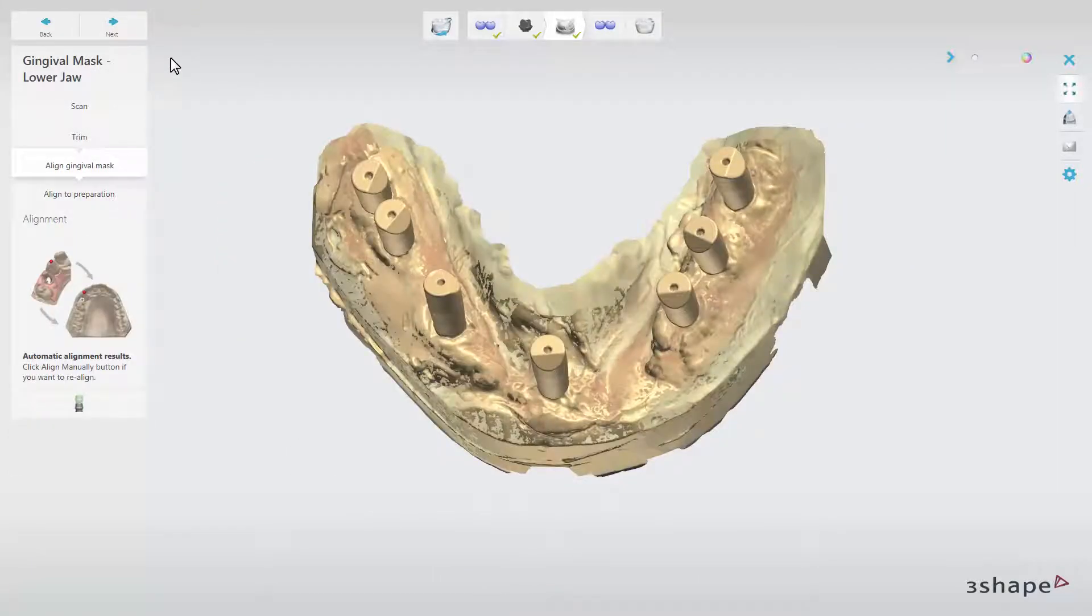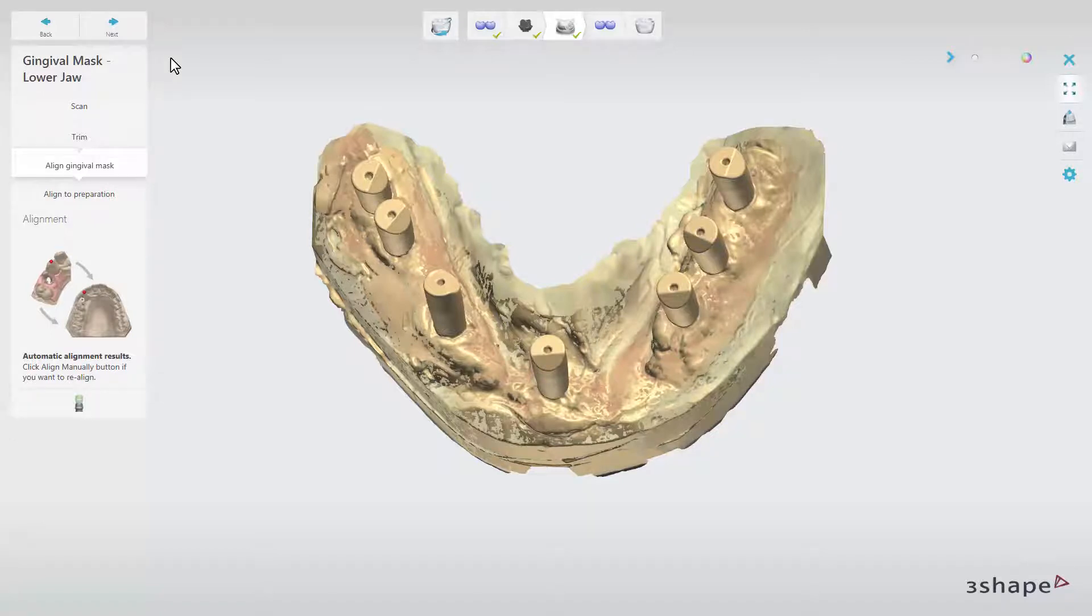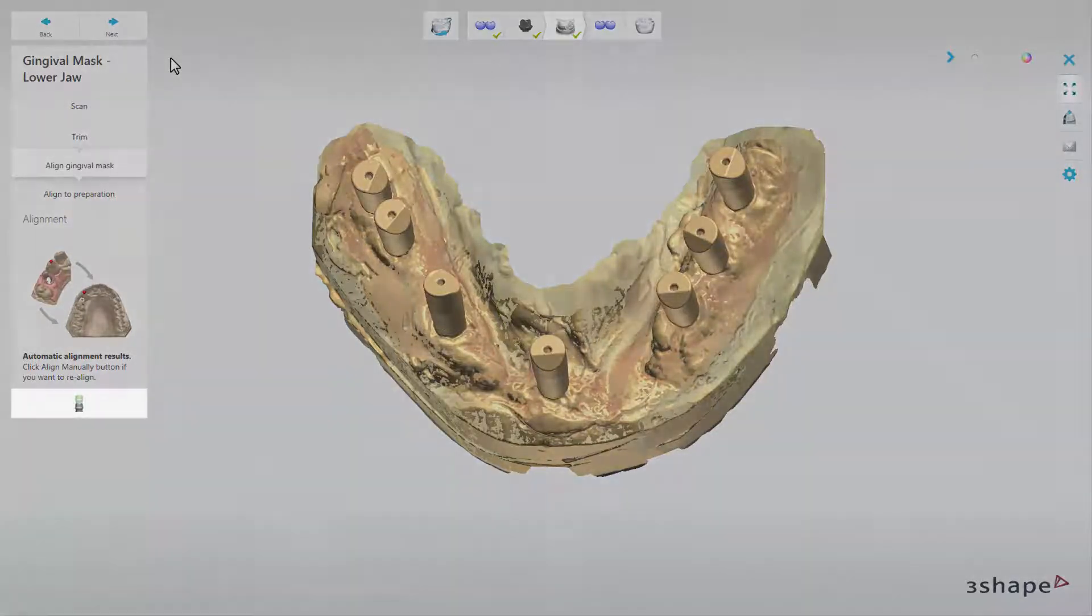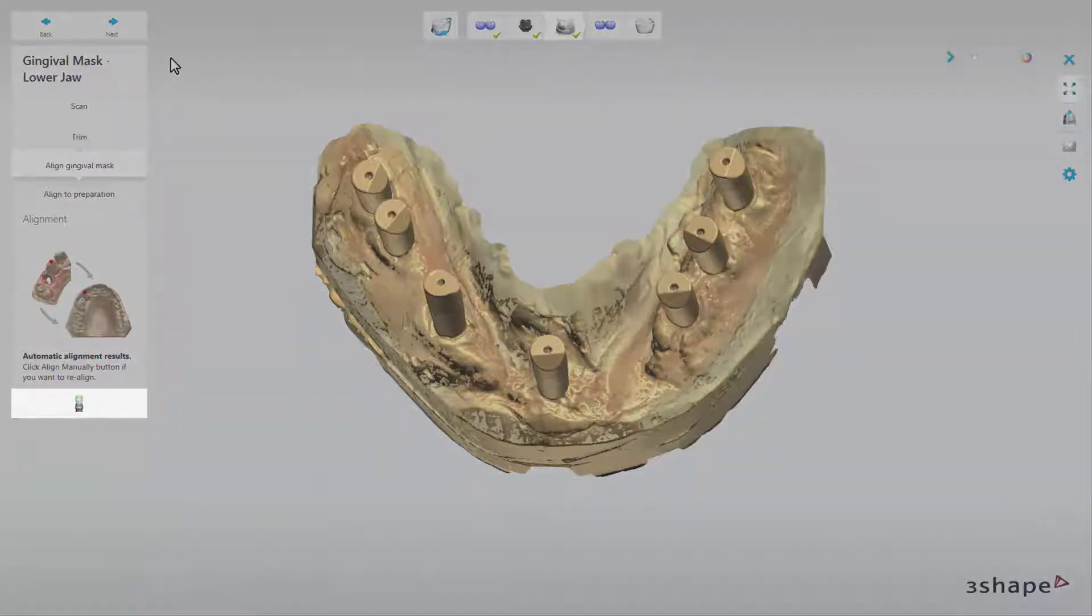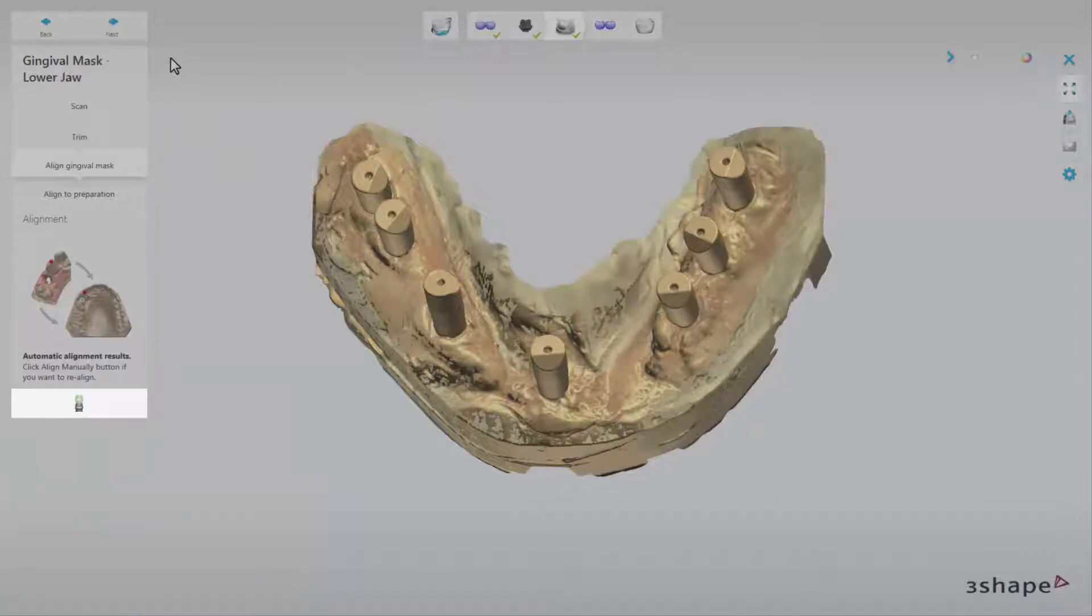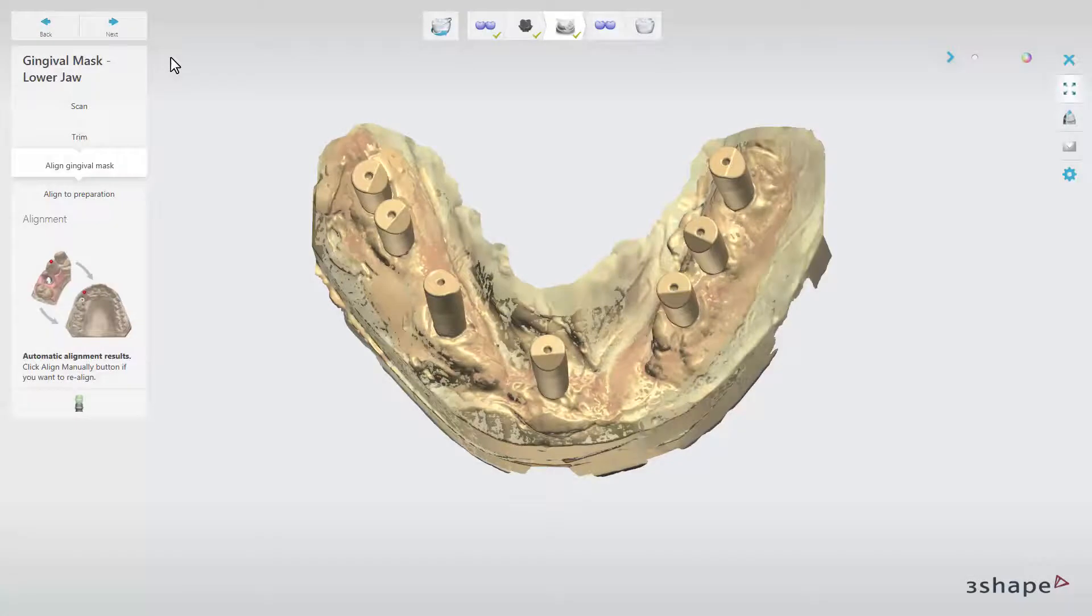In the first sub-step, Align Gingival Mask, the Gingival Mask and the preparation model will be aligned automatically. However, you can always use manual alignment if needed. To do it manually, simply choose the Align Manually button. Click Next.